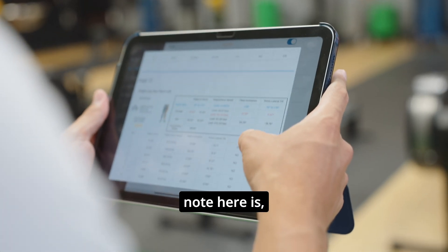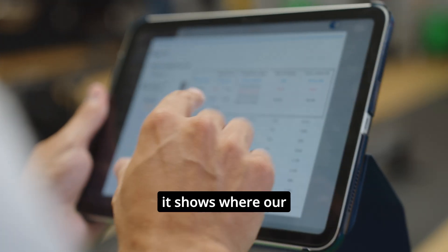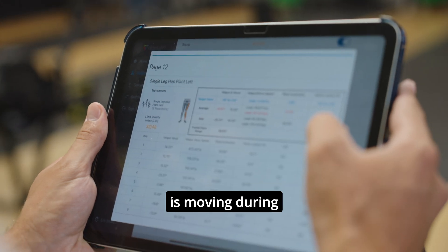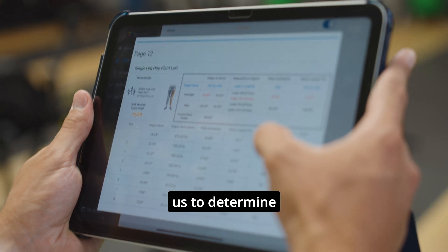A couple things that we want to note here is, especially during some more dynamic movements like hopping or squatting, it shows where our knee position is and how fast that knee is moving during the movement. A lot of this helps us to detect things like ACL prevention and helps us to determine injury risk moving forward for the athlete.